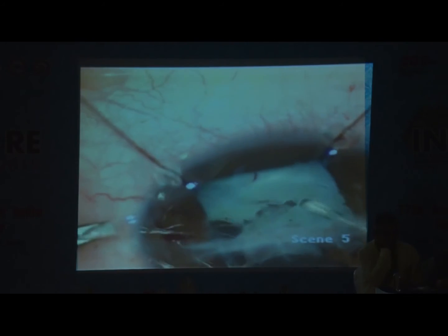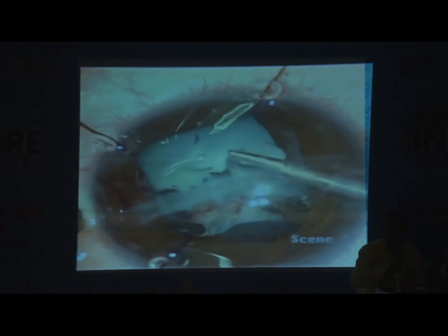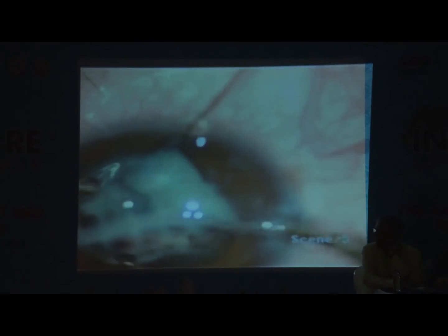There's another traumatic case where we had a non-dilating iris with synechiae. We used iris hooks to expose. We made an anterior capsular opening, using the ILM peeling forceps for that. Then we used a vitrector to clear the visual axis and do lens aspiration. After that, we made a primary posterior capsular rhexis and placed a 3-piece IOL into the bag. Using a vitrector, we had to do a PPC because there was a thick PC plaque right in the center.